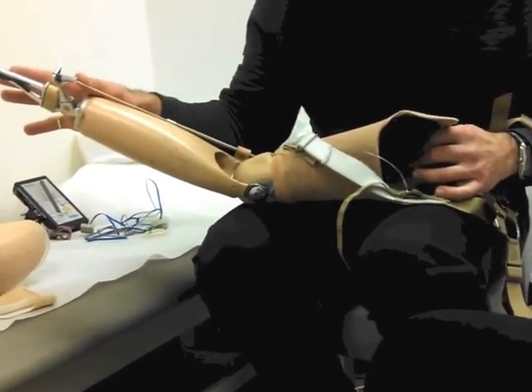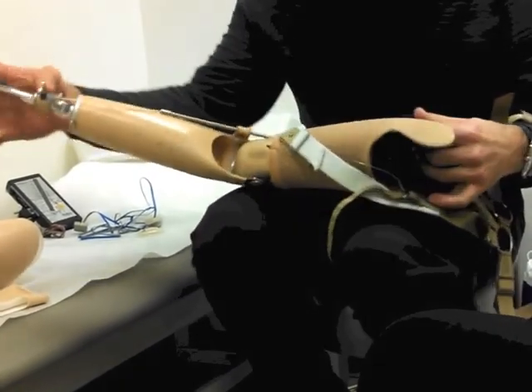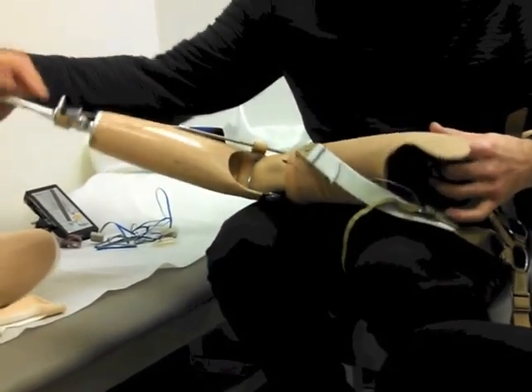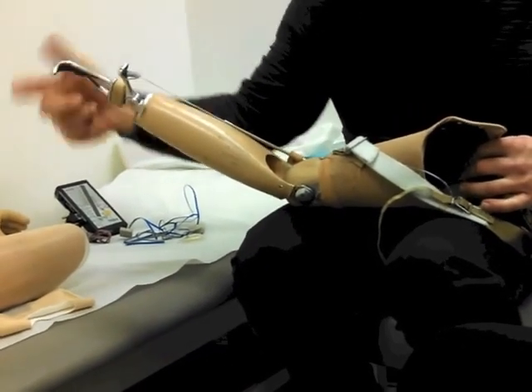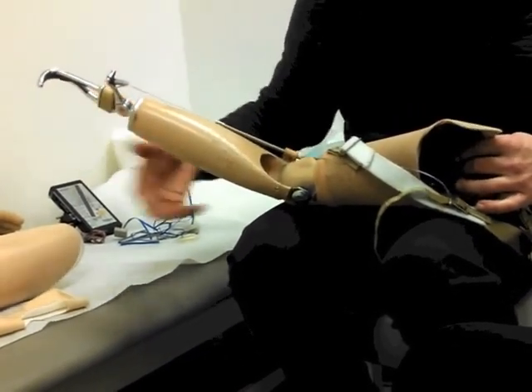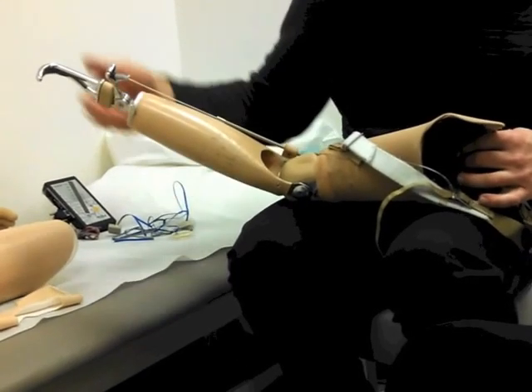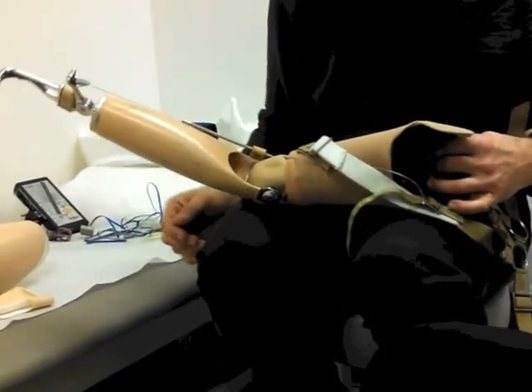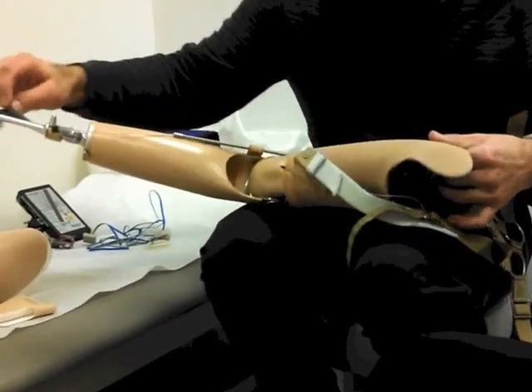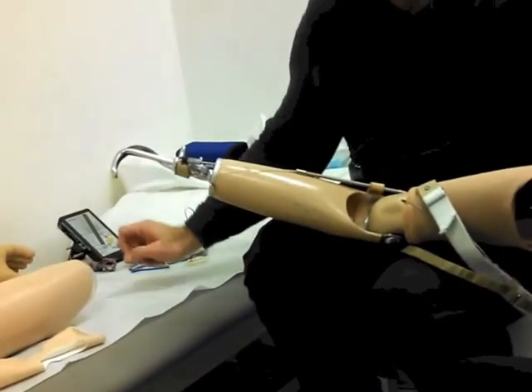They do make several types of it — this is the most common one. They make one with a bigger opening, a bigger throat opening here. They have one called a work hook — it actually has a 90-degree angle at the end, so for farmers or somebody who picks up a bucket, you put it underneath the handle and it won't slip off. This one here can slip off. But patients use this little cutout here to put their pen in and they can actually write with this.